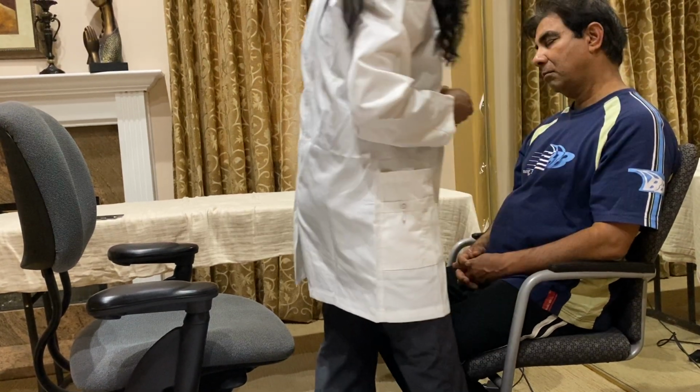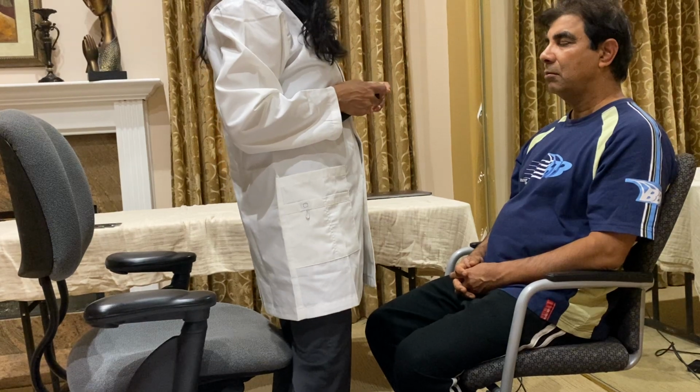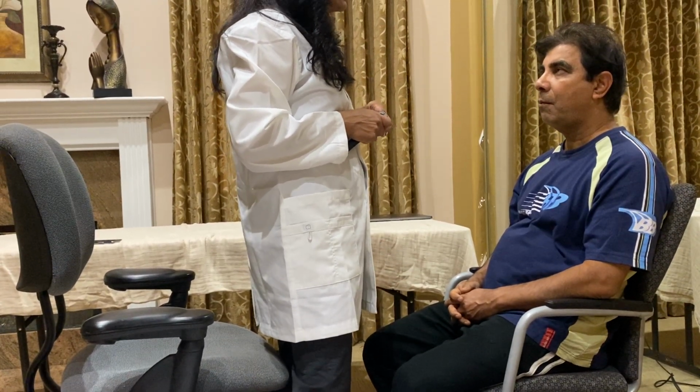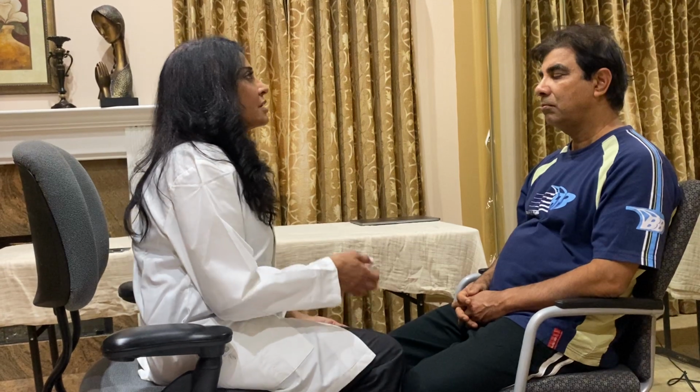The eardrum is pearly white, pearly gray, and then since this is his left ear, the cone of the light, I did see it in the 7 o'clock position. Saw the eustachian tube opening. I also saw the ossicles behind the eardrum and the cochlea.